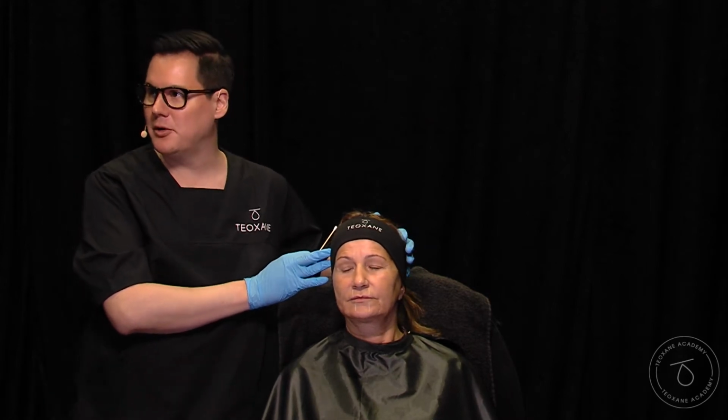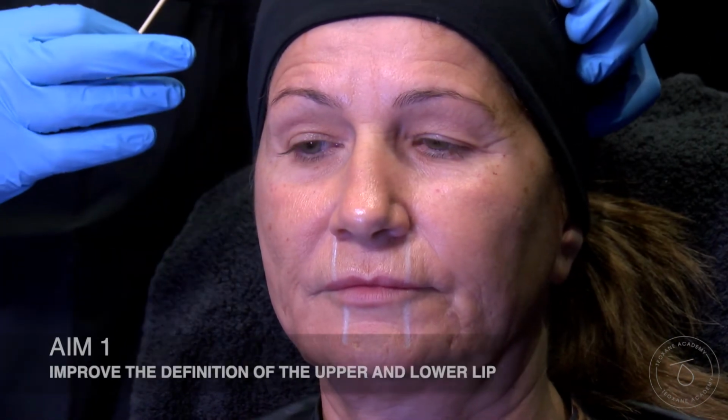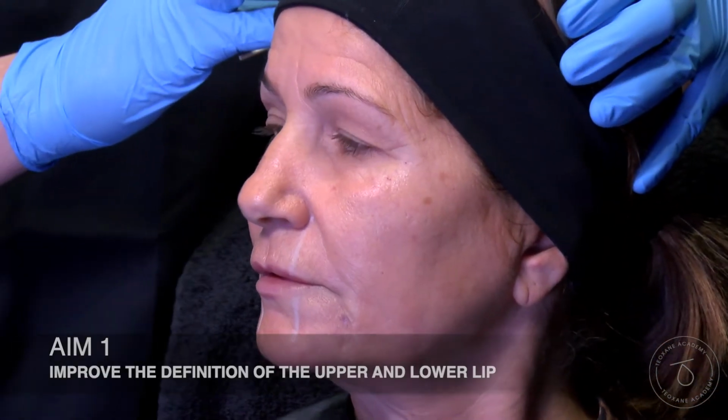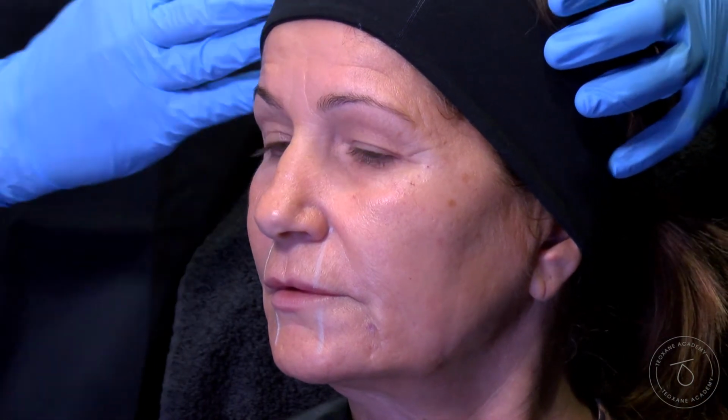We've got our beautiful model today, who I think you've all met now from earlier on. Her main concern is she's not asking for volume here in her lips. She's asking for more definition. And especially from a profile, if we just have a look at her profile, she thinks that she needs more projection of her lip, especially in her lower lip, as you can see.